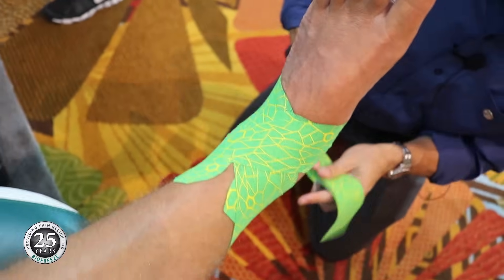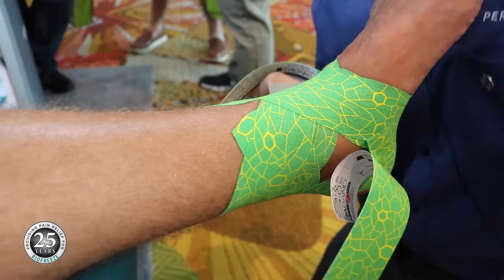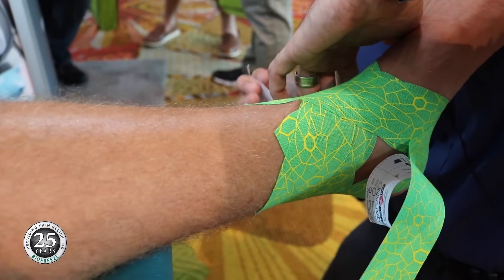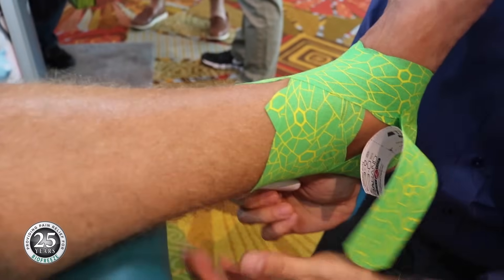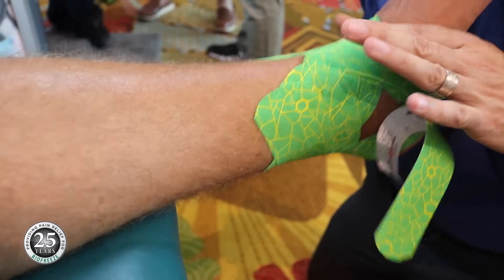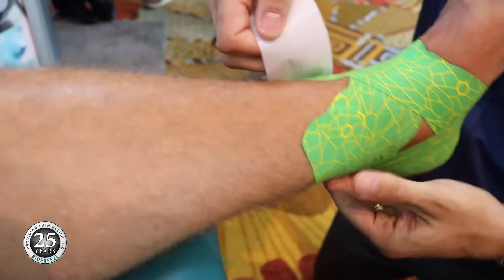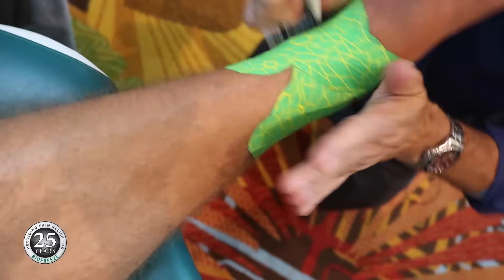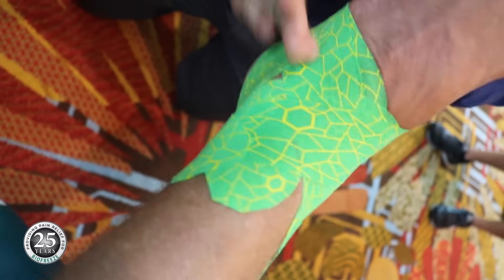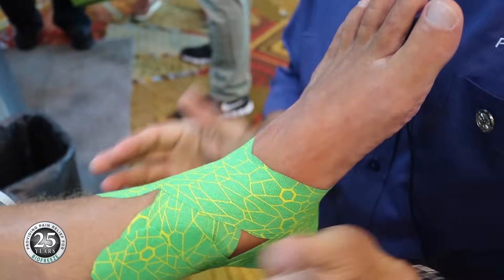And then the last one for the subtalar joint — heavy stretch until you get behind, and just let it go. Heavy stretch, and then just let it go. That's going to give a lot of stability to both the subtalar joint as well as the ankle mortise joint.